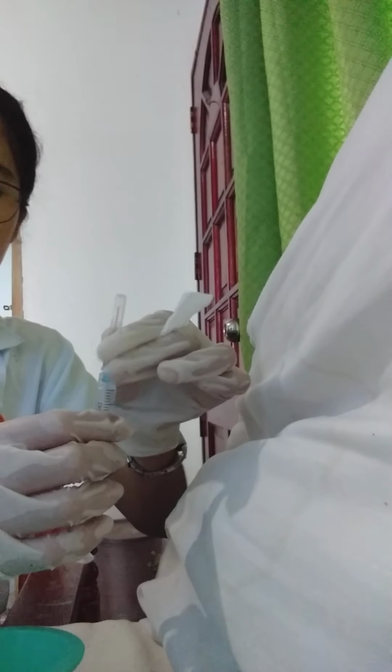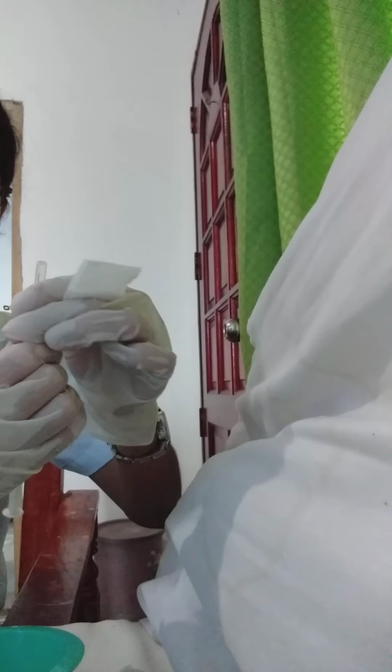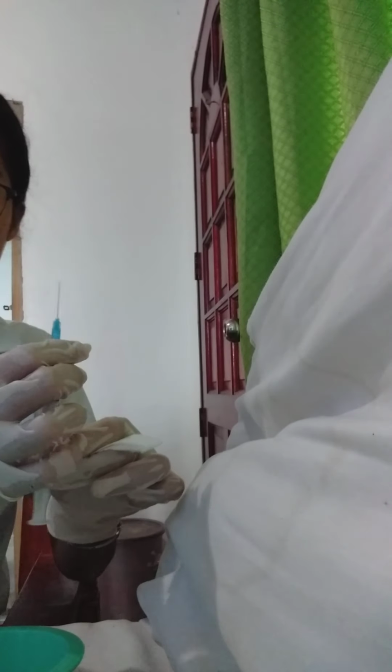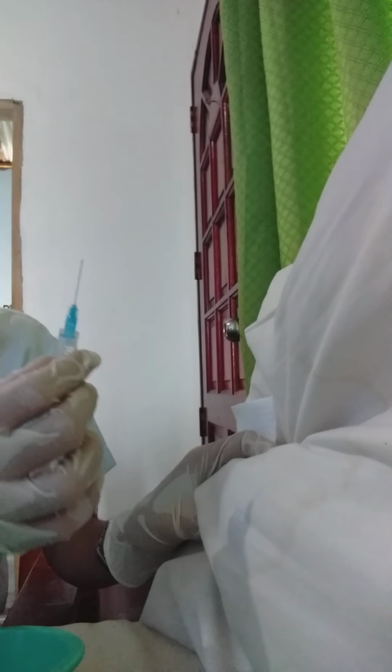Then we have to remove the cap. Then we have to inject the medication at a 45-degree angle. Grasp the syringe with your dominant hand, with the bevel facing upward.